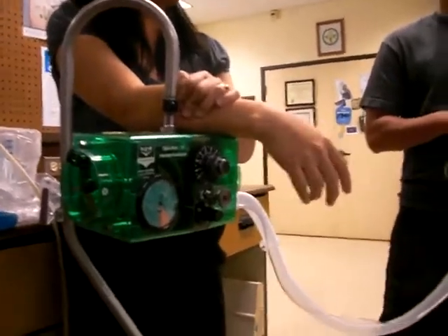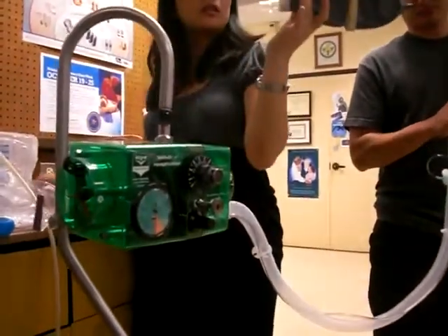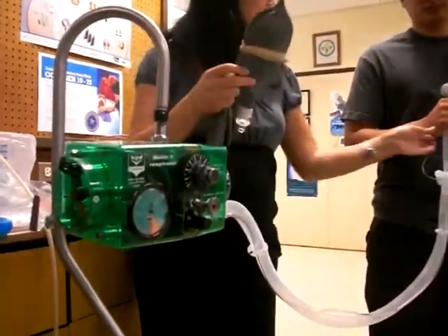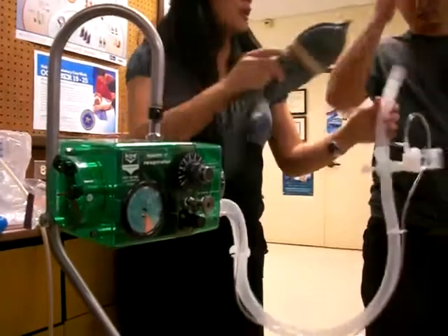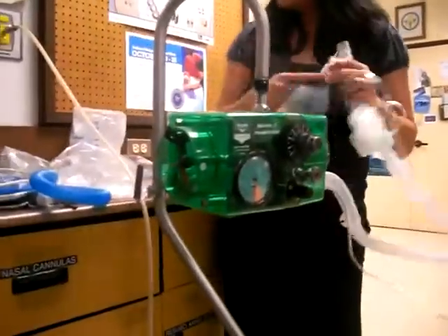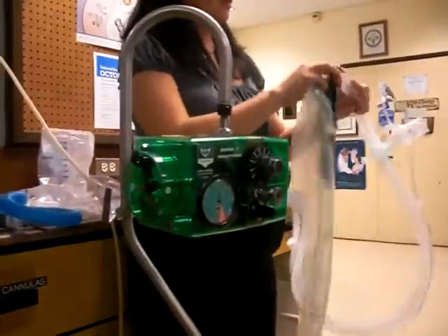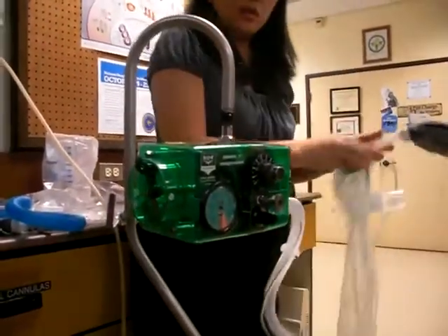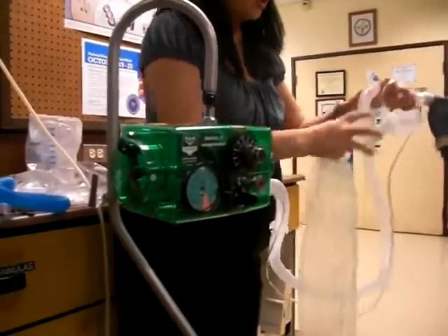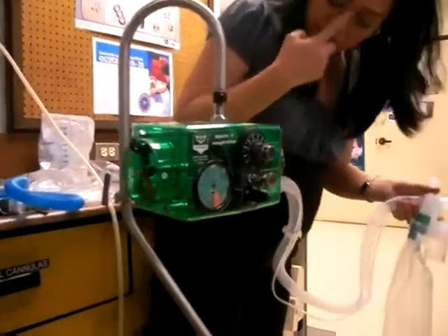So what you could do is, if you're here early in the morning, you play with it. We have test lungs here, or you get your own thing. You can take off your own filter. Steve, show you how to use this? Mm-hmm. Yeah. Okay. You put it on the exhalation side. And let's see how much volume we're getting.